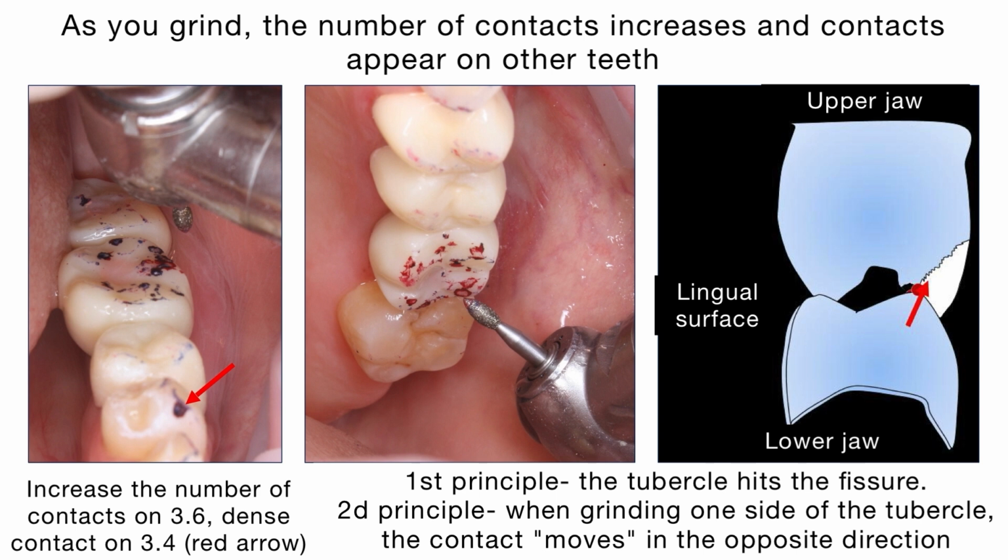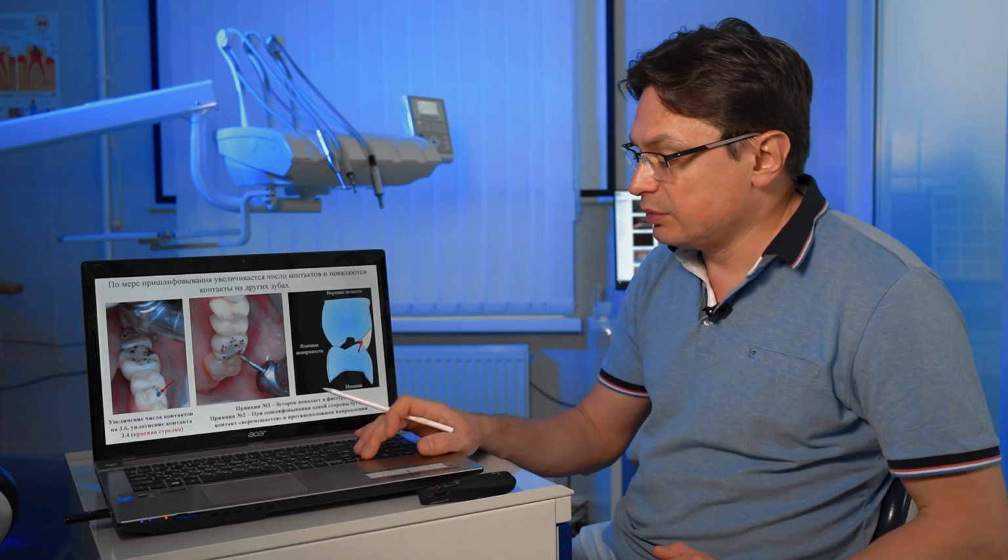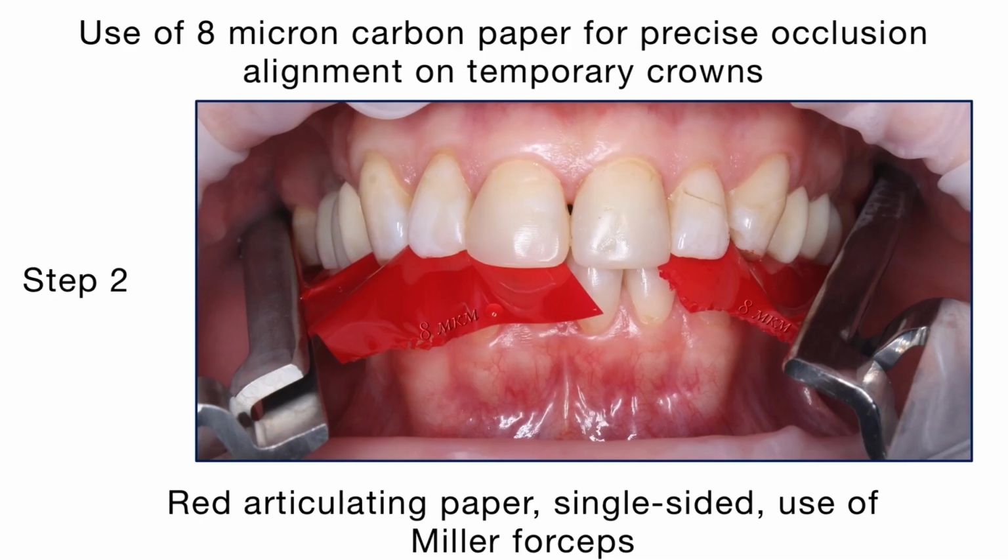Then I grind other teeth. I have additional contacts since I removed the earlier contacts, and guided by the logic of tubercle-fissure, I carry out further grinding.